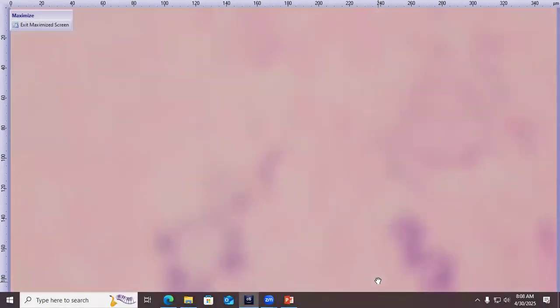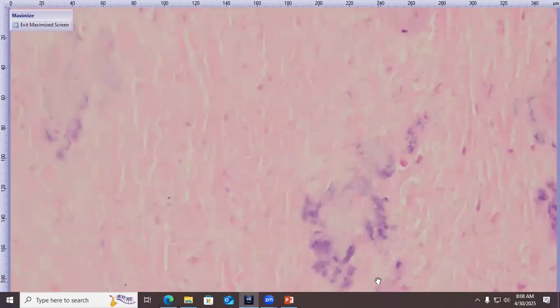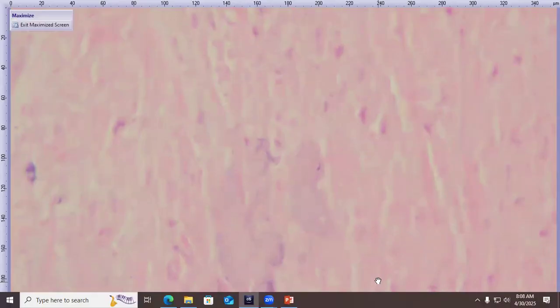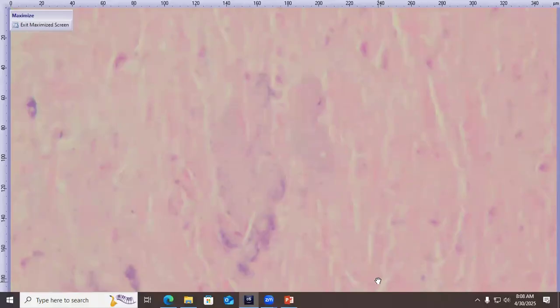We have another little slice of tissue here. We just got kangaroo. I don't have a specific breed of kangaroo, or species, I guess, not breed. What's that? Like a tree kangaroo versus a larger? Your guess is as good as mine. It was a pretty large globe, so yeah. So you can at least say that. So repeat: the question just was what kind of marsupial, and all we got was kangaroo. It was a larger globe, so presumably not a smaller species of kangaroo.